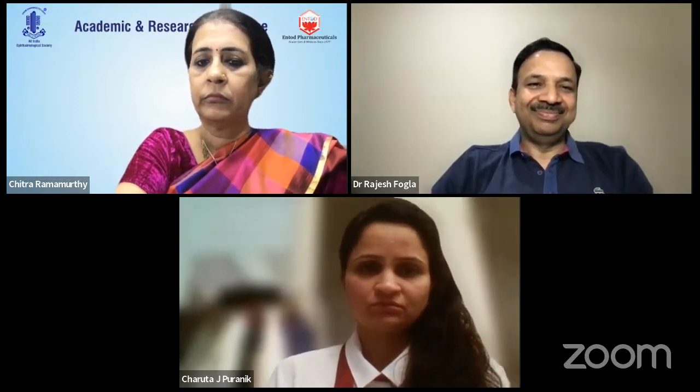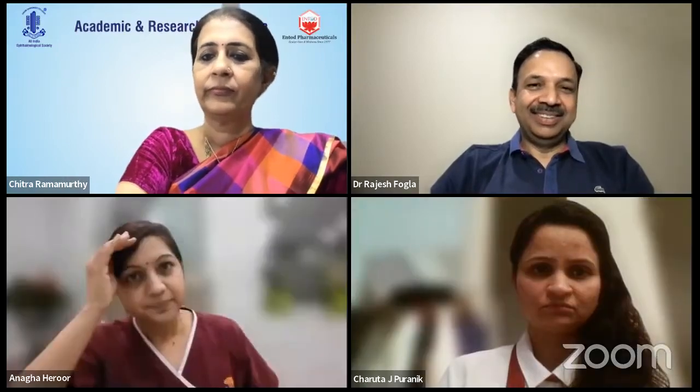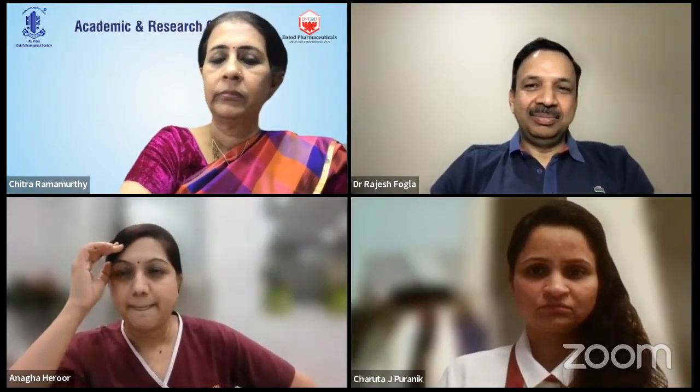I think the greatest role is in our DMEK surgeries. I know Rajesh is a very accomplished surgeon and can do without it. But I think Dr. Radhika will agree completely that we have become so dependent on it that we become helpless without it. And it plays a very important role as far as the general ophthalmologists are concerned for cases of persistent corneal edema after phacoemulsification. Because all you need to do is do one AS-OCT and see whether there is any DMD or not, and you can immediately address it.